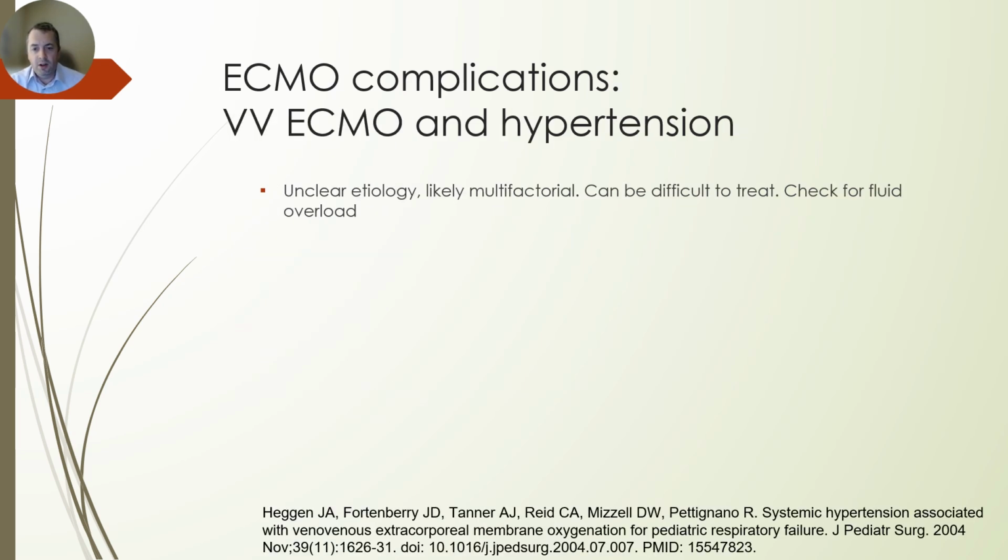VV ECMO seems to be able to cause hypertension, which can be pretty high. No one really knows why. Likely multifactorial. It can be difficult to treat. Recommendations are to just make sure that the patient's not fluid overloaded, and then treat hypertension with standard measures.